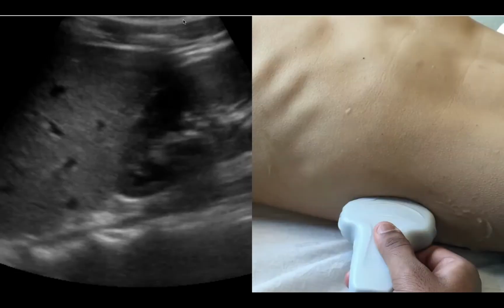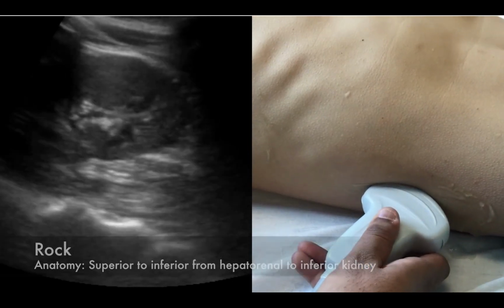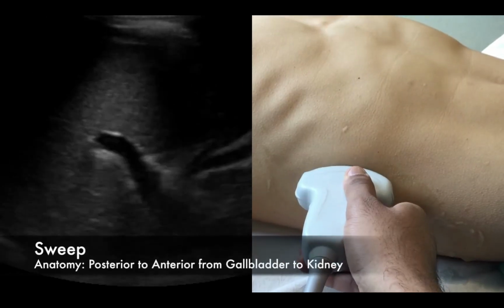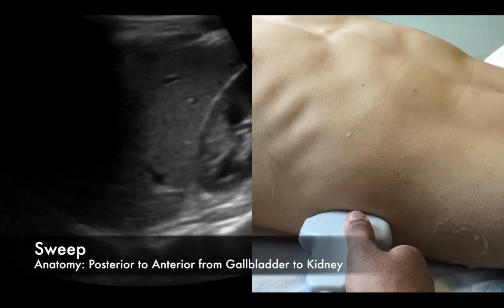Sometimes you can further adjust the sliding movement by rocking the probe back and forth along its own axis. This can often help stay in the same rib space once you've found a good spot. Next, you can sweep through a tissue by moving the probe perpendicular to its axis. This will allow you to scan through the plane you're in, in this case the coronal plane.